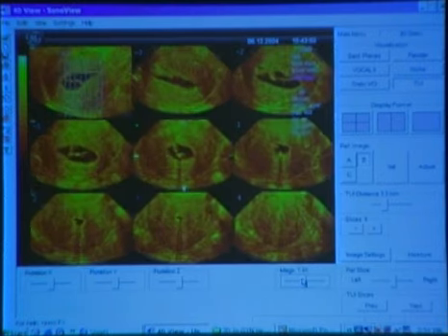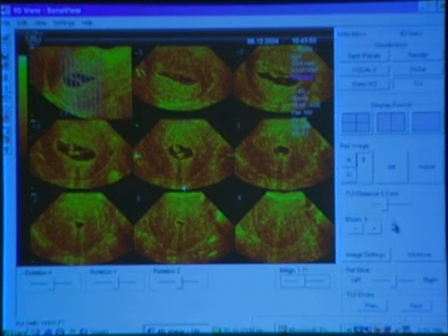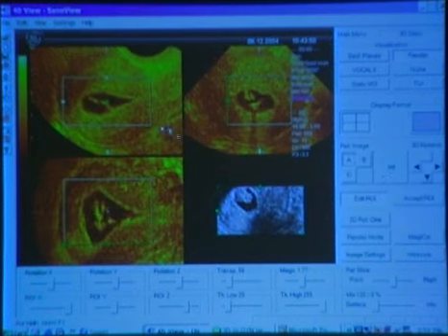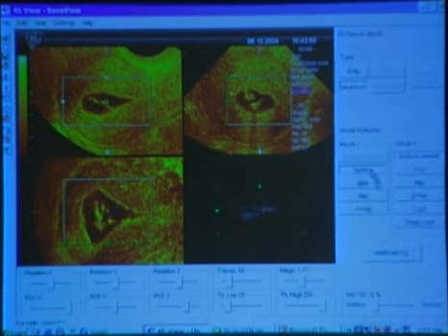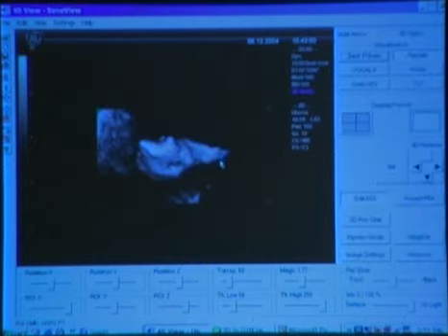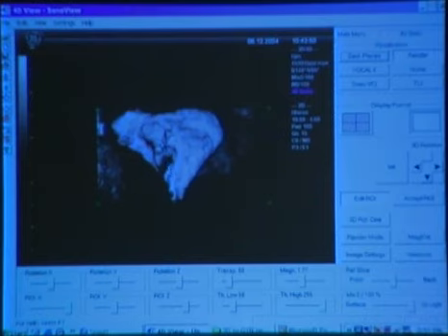You can enlarge them, you can move them around at will, and once again, I will also show you, if I'm already here, go back to the sectional planes, do the rendering, try to fit this into the area of interest, go down to the render mode, invert it, put the surface rendering, do the gradient light, and then try to make it appear, go back to display it in one plane, move it around a little bit, turn it, and you can see here the two depressions of the polyp, the areas there.